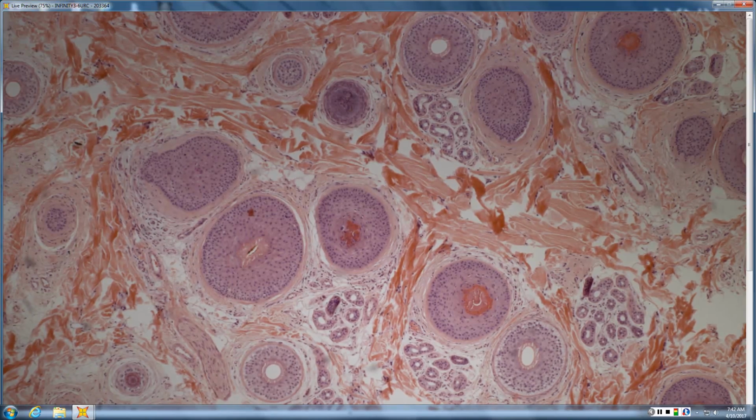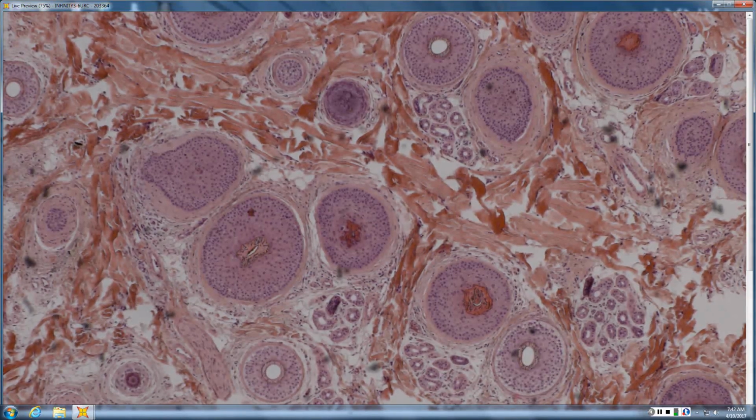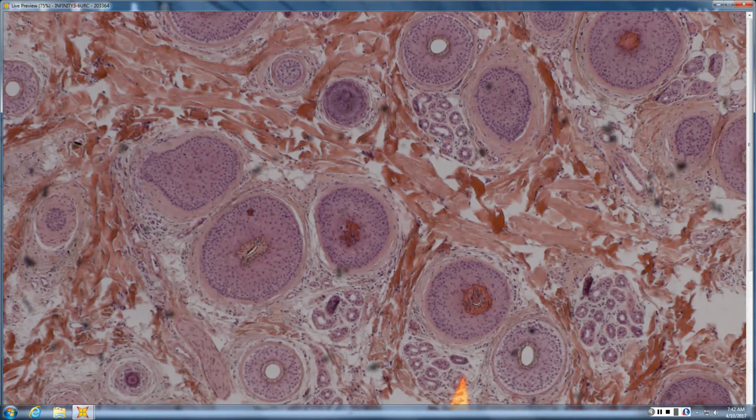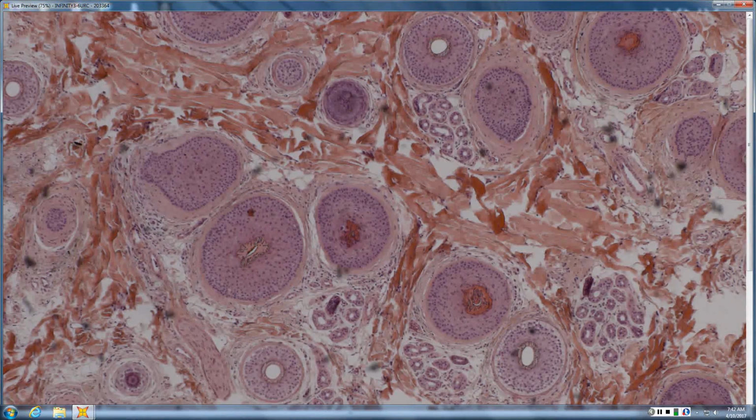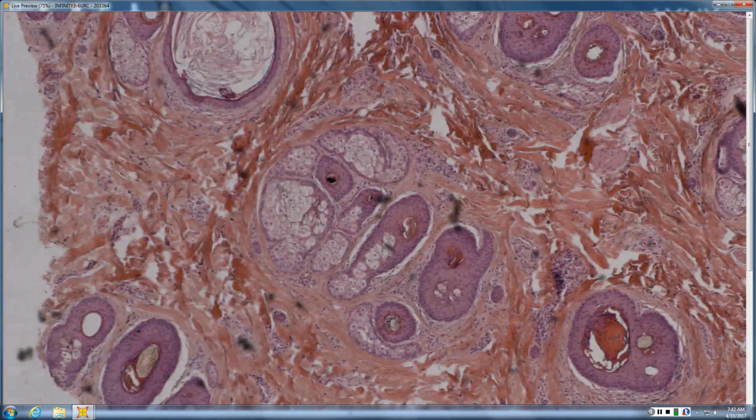So then you start looking at other features. Do you have any pigment in fibrous tract remnants? Do you have any peribulbar infiltrate? Do you have weird shaped remnants of keratin in the follicles? Yes, that's a yes. And then sometimes you'll see strange fractured hair shafts in trichotillomania. The pigment casts in the follicular channels, you can see in any of the 3. So the pigment casts don't help you.